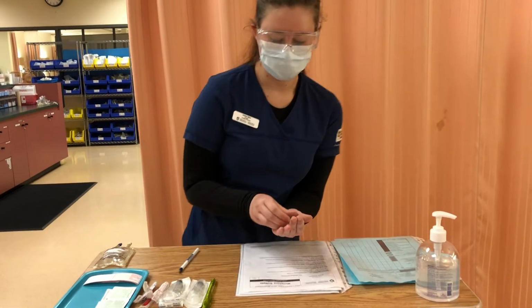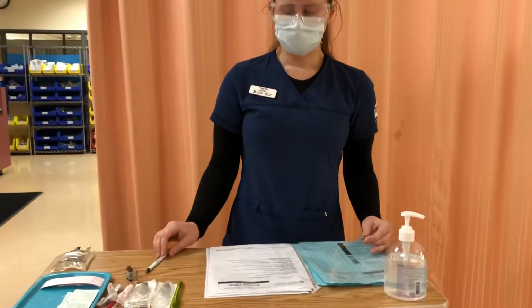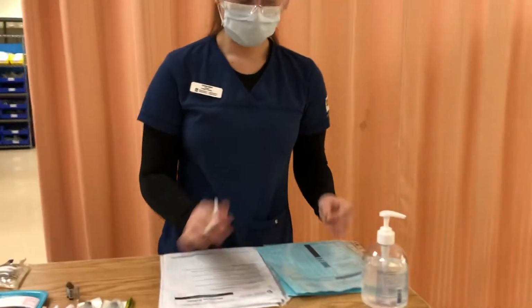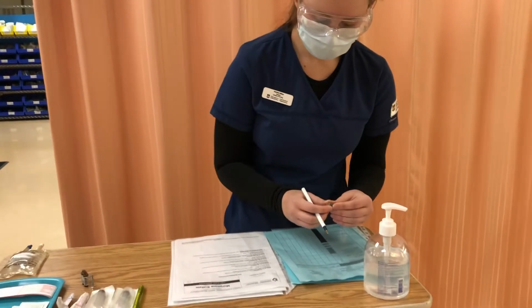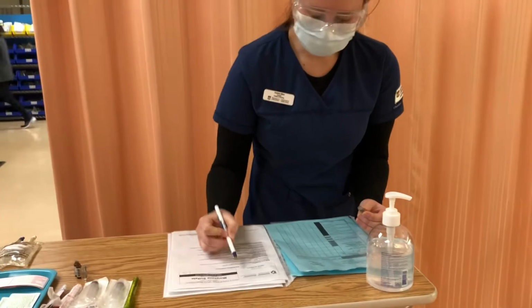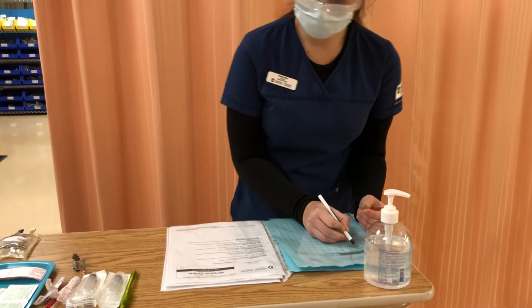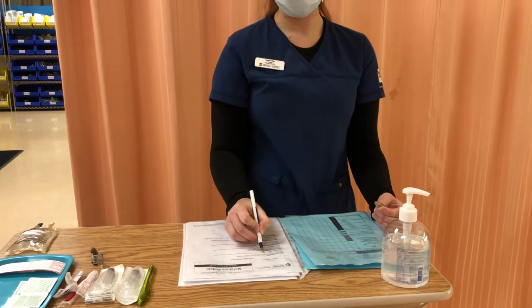So in clinical practice, I will be doing every check with every ampule, but for demo purposes, I'm going to be doing the check with one, just to save some time. So I'm going to begin my first medication check with the MAR, PDM, and the medication ampule. So this is from Marcy Paris. This is PCA, so this is the recipe for PCA. This is morphine, 1 milligram per milliliter. So here I have the recipe for 1 milligram per milliliter.